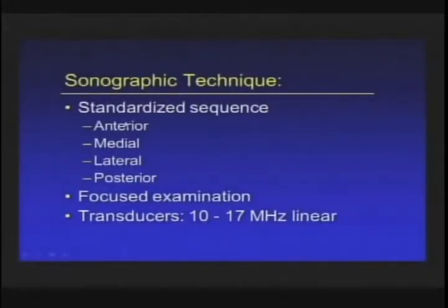So as you saw, I tend to approach every elbow the same as a radiologist, just like I'd read an MRI in the same sequence, and I try to get as much information as I can. I start, just like I did here, anterior, medial, lateral, then posterior. Now, in a busy clinical practice, or if you're a clinician, you could target your exam, of course, to where the money is, but make sure you consider a number of items in that quadrant as your focused exam.